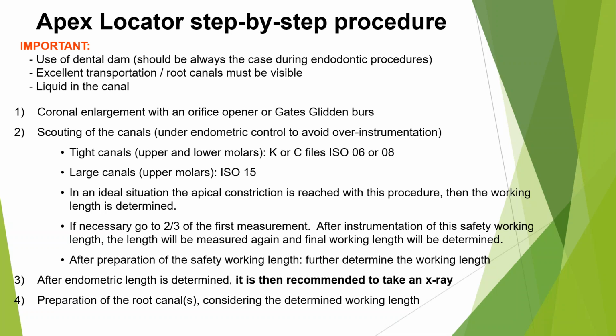So I think something that Gray was alluding to was, let's say you've got your 06 connected to your apex locator, and regardless of what canal you're in, that's your go-to apex locator file.